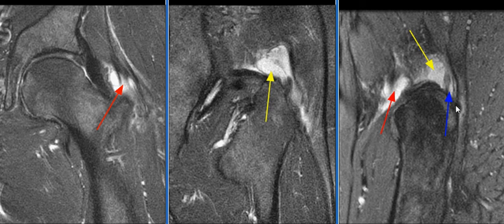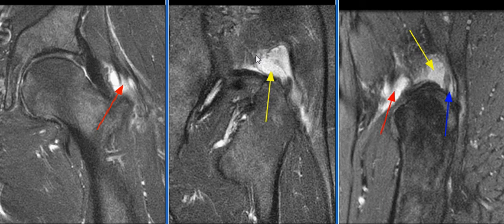There is extensive partial tear of the posterolateral aspect of the gluteus medius muscular and tendinous insertion with nearly 1 cm of tendon retraction, as seen on this image with the blue arrow. Fluid is seen in the subgluteus medius bursa, consistent with bursitis.